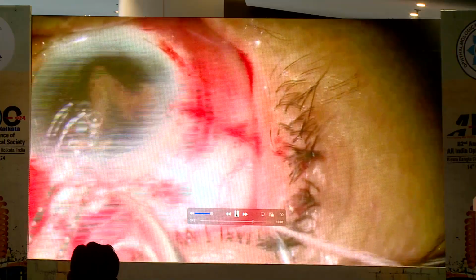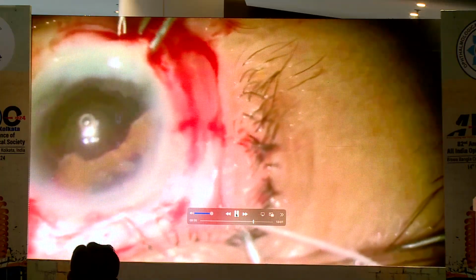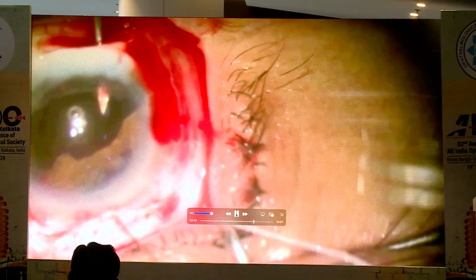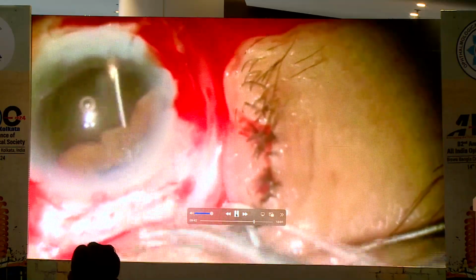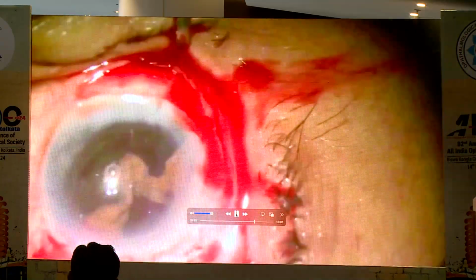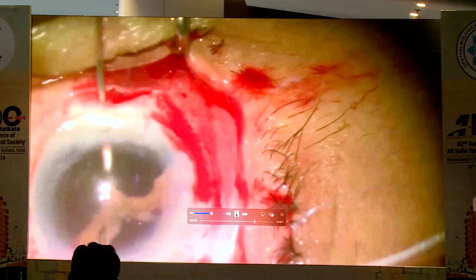After injecting it, the pupil is moving and unfolding. Then ultimately the diagnosis changed. That is nothing but a severe case of iridodialysis. You can see how the suture and the iridodialysis appear in this case. Earlier, only a small remnant was visible.